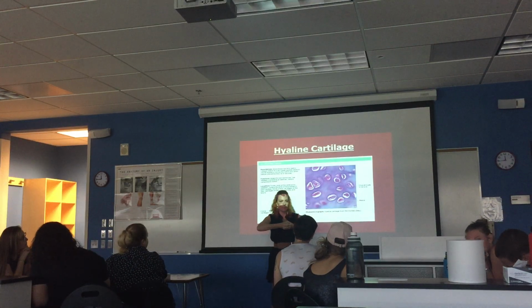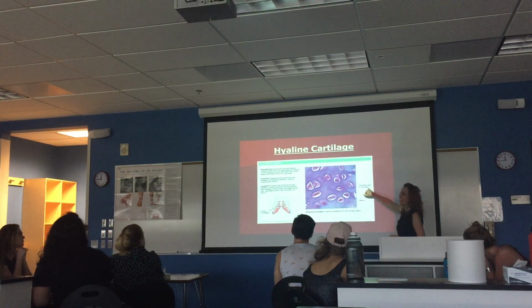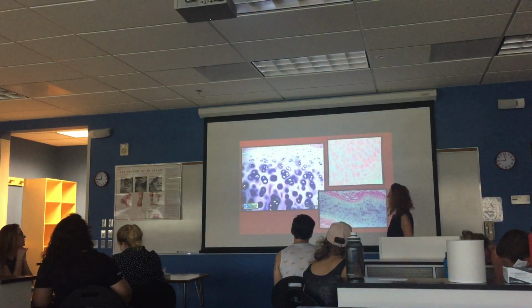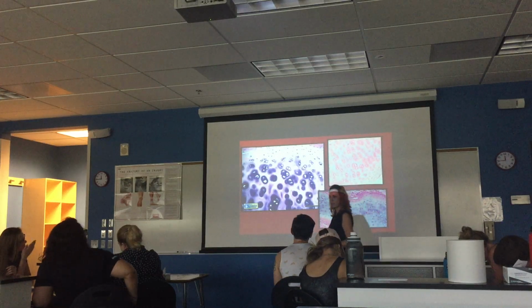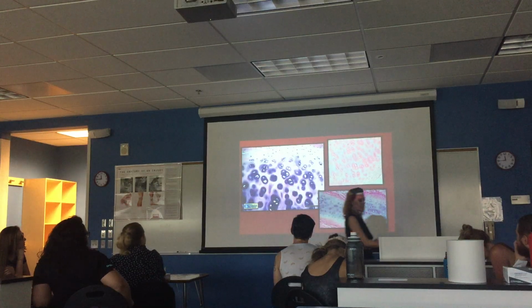That's how you can identify them really clearly. The cavities are called lacuna, or lacunae if it's plural, A-E. So chondrocytes living in lacuna is what you will see on hyaline cartilage. It's kind of furry.